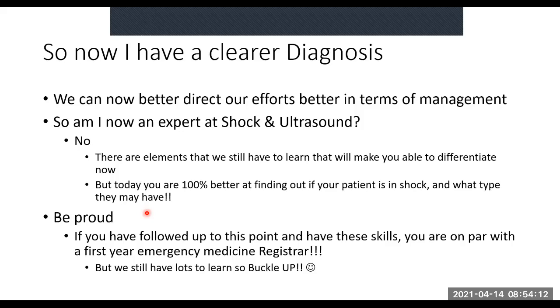The reason being, sometimes it's very difficult to see subxiphoid and long axis views, so we have to have the short axis and apical views, which I'll show you. And Malusi is going to model for us, hopefully today or tomorrow, so we'll put that on there. Ectopic pregnancy, because it's one of the common reasons of hypovolemic shock. TB abdomen, because it's one of the common diagnoses in South Africa, and mimics peritonitis in acute abdomen. And we need to know how to put in CVPs as well, all right? So that's what we're going to do.